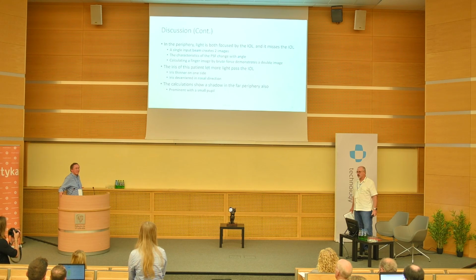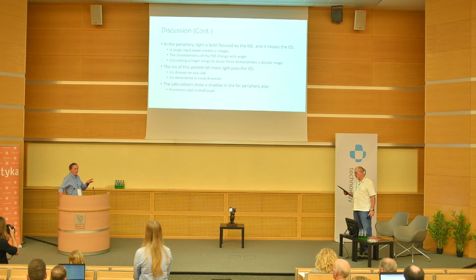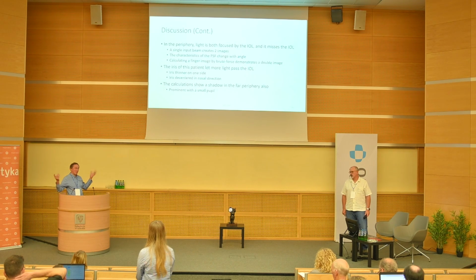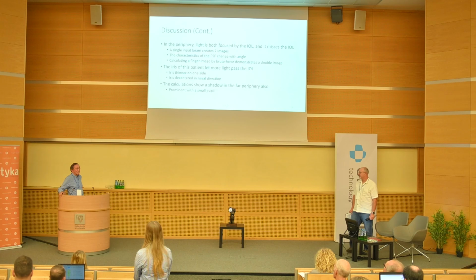The literature is just vague as to what the patients complain about and where they complain about it. But it's generally a very bright illumination, and my guess is it's like you go into a supermarket and you see shadows and it bothers you. Things move, you see like a double image in the periphery and it bothers you. So it's a thing that comes and goes. But when you ask the patient about it, they say, well, I see a shadow. After 20 years of people describing it, nobody's really described, even for one single patient, what is it that really bothers you? It just seems like there isn't that description.